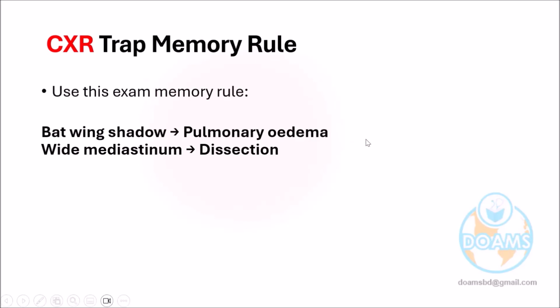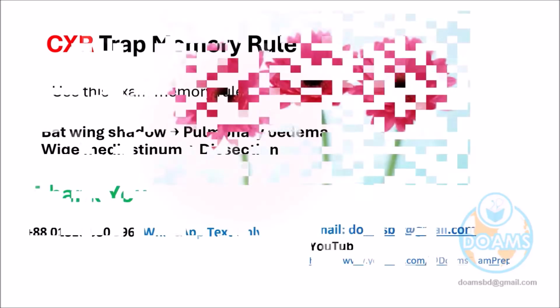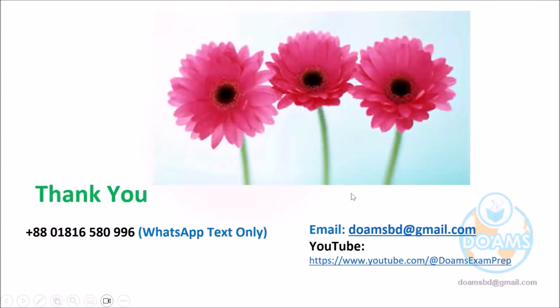And then a widened mediastinum can confuse clinically with coronary artery disease. There may be associated coronary artery disease also. The great mistake will be if I think this is coronary artery disease, that means myocardial infarction due to coronary disease, but underlying dissection is there. A great mistake could be made. I am giving aspirin, I am giving thrombolytic therapy, and the patient would die immediately. Clear, Dr. Javed? Yes, I think it is clear. Thank you very much, doctor. Any query until now?